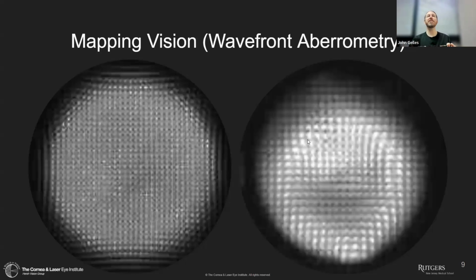This deviation that we're seeing here in the focuses could be caused by a deviation in the crystalline lens, the front of the crystalline lens, the back of the crystalline lens, the front of the cornea, the back of the cornea. We don't know. All we know is that there's deviation there. In this case, though, we know from the topography that this is a patient with keratoconus. But what we're going to do here is show you the raw sensor images.